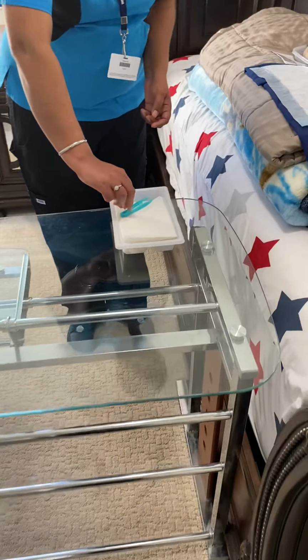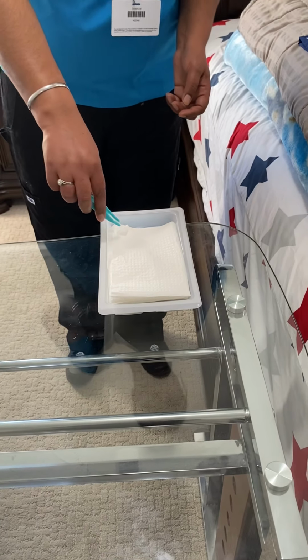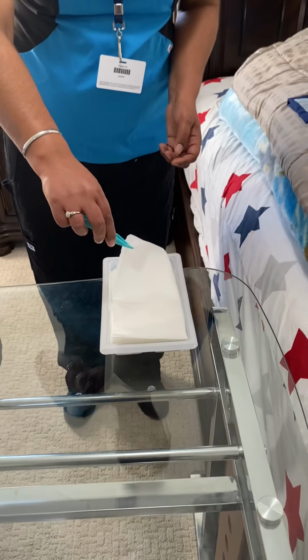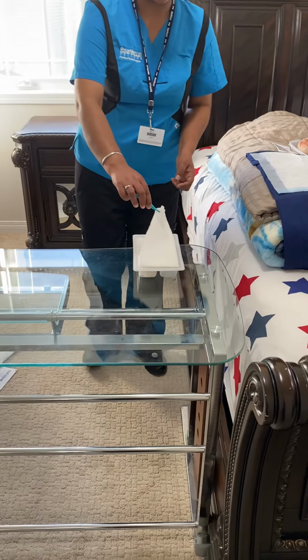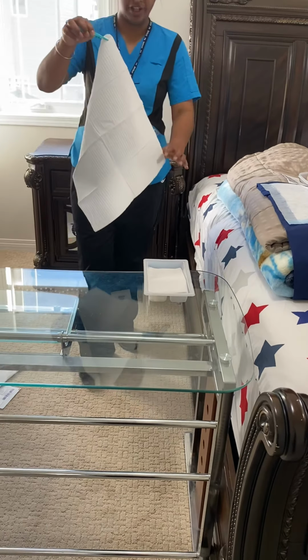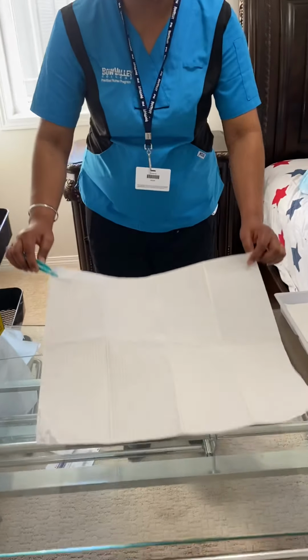I take it from the side and I take the first drape and going backward, with the shiny part down, place it on the table.